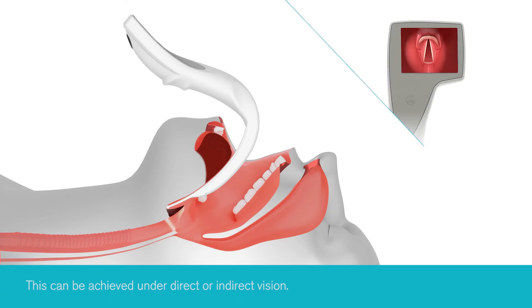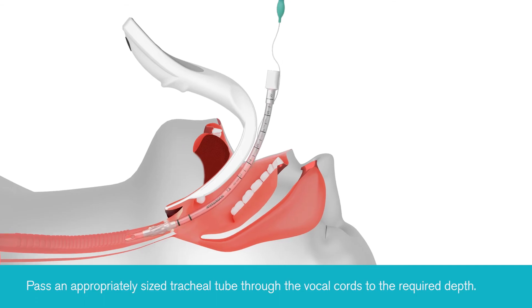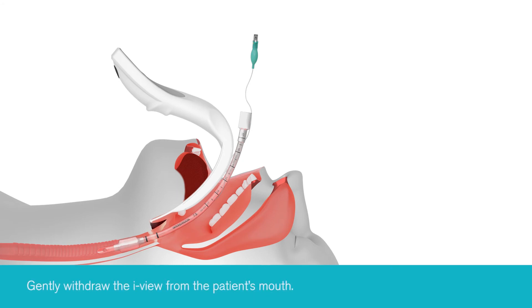Once the glottis has been identified, an appropriately sized tracheal tube can be passed through the vocal cords to the required depth, and the iView gently removed.